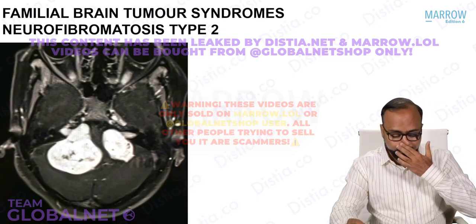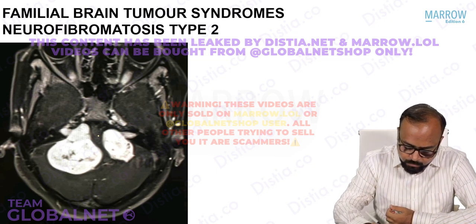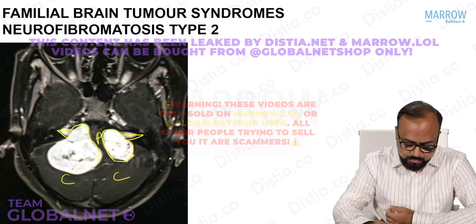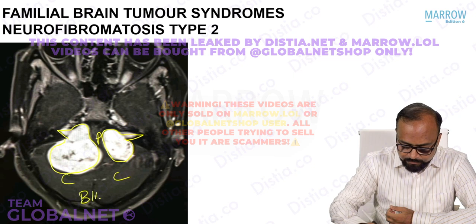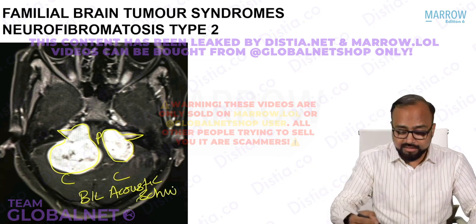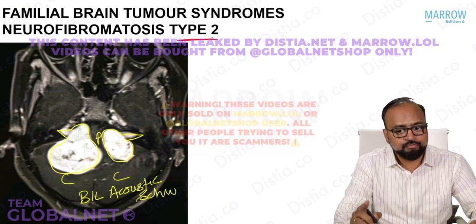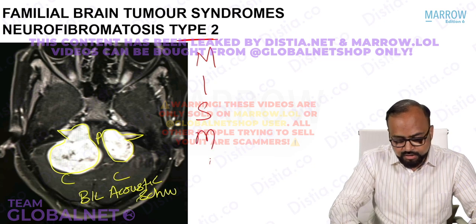Yes. Now we come to neurofibromatosis type 2. See, this is a very peculiar appearance. Do you remember this? We have seen pons, cerebellum, and an ice cream on a cone appearance. Can you see that? So ice cream on a cone appearance suggests what? It suggests bilateral acoustic schwannomas. And bilateral acoustic schwannomas are associated with what? They are associated with neurofibromatosis type 2.